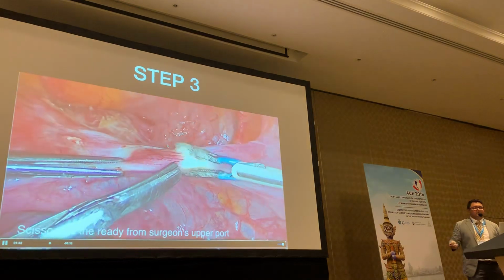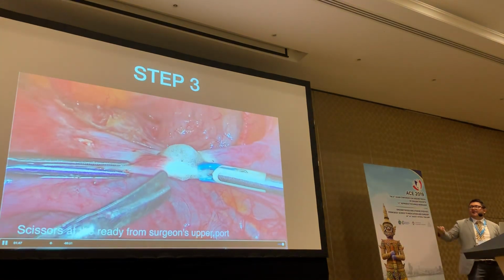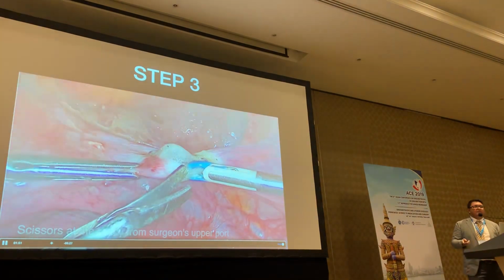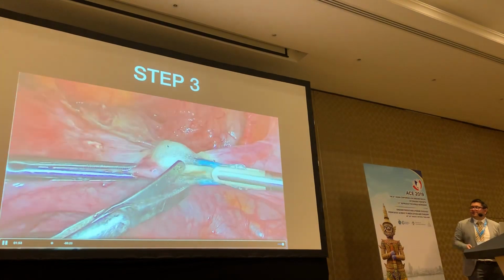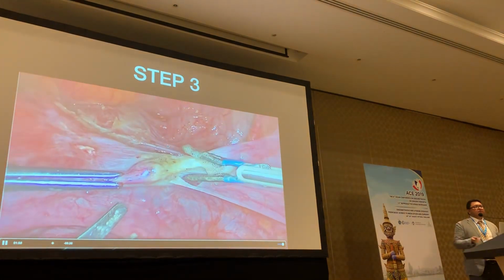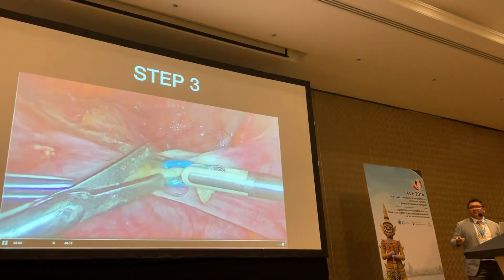Because this is a smaller uterus and because I'm a little more medial with my right hand port, I can afford to cut with the scissor here. You may not be able to in larger uteri or different pathology, so then your assistant has to alternate, or you can use what I learned during my fellowship at Chang Gung, where you give the assistant 2 ports as well.